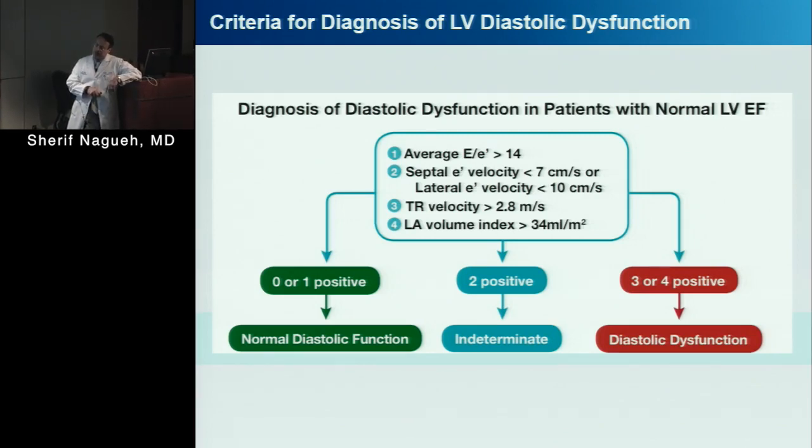It was published in one of the cardiology journals, American Journal of Cardiology, from the Heart and Soul study, and prediction of outcome was not any different when you use the body surface area to index the LA volume as opposed to other ways of indexing LA volume to body size. So indexing is always difficult, because that index can be all over the place, particularly with obesity. We use it less, but in extremes it becomes troublesome. That's the way I see it.